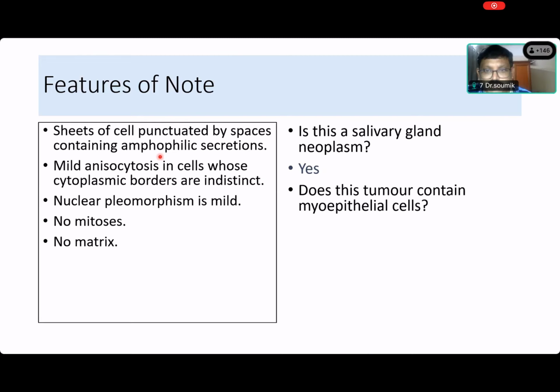Yes. Basaloid or plasmacytoid, hyaline cells, or stellate-looking or spindle. Stellate-looking? Somik? No. Those are myofibroblasts. Spindle cell. So they may be basaloid, they may be short oval, they may be plasmacytoid, they may be spindle. But did we ever see a myoepithelial cell that has abundant pink cytoplasm? Have you seen it so far? No. We saw some myoepithelial tumors, didn't we? Myoepithelial-containing tumors.